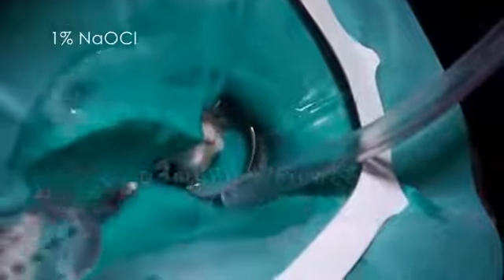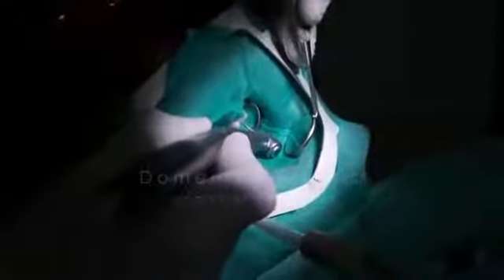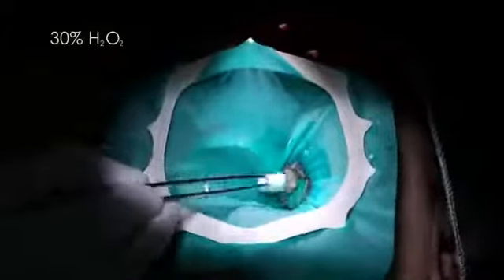This is a modification of the disinfection protocol proposed by Muller. The temporary restorative material was removed and the field re-disinfected.